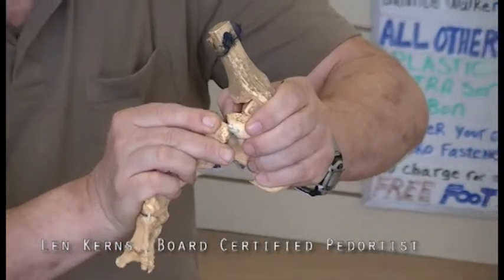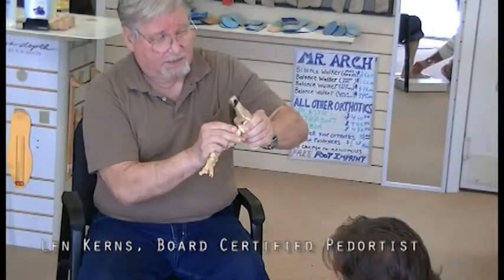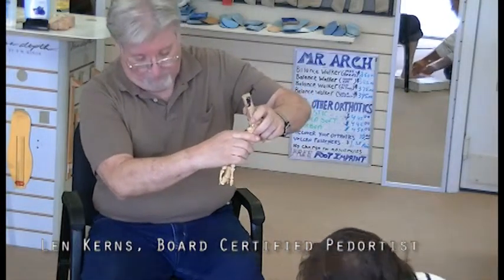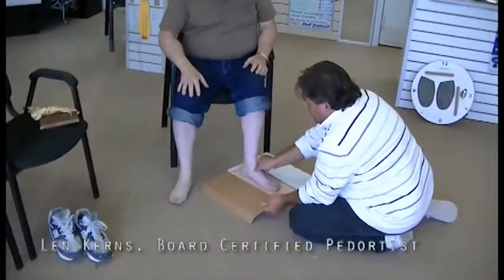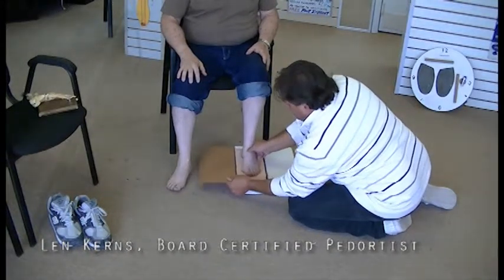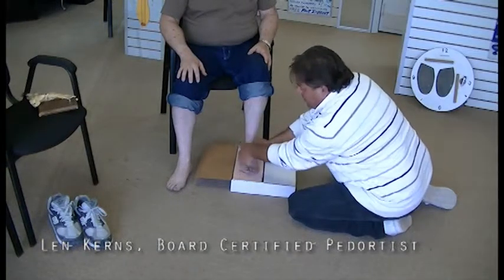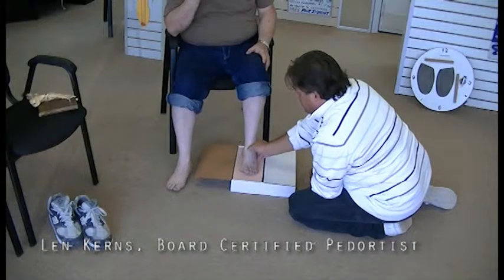So by turning the box, you're actually turning the ankle assembly in and out until he feels where all these bones get together. Now, when we turn the box counterclockwise, the foot is pronating further down into the foam. When we turn it into this position, a clockwise movement with the left foot, now you can see the foot came up into the proper subtalar neutral position.